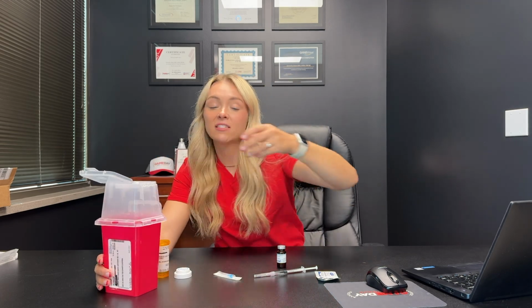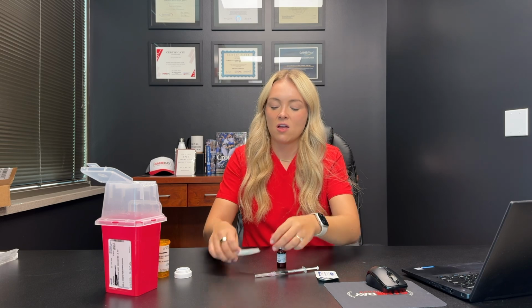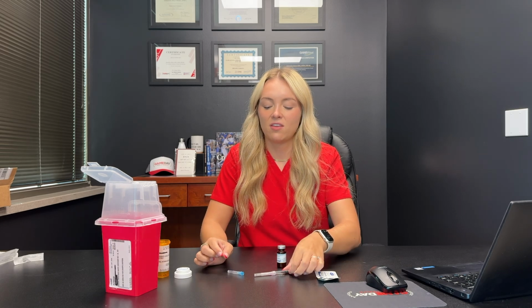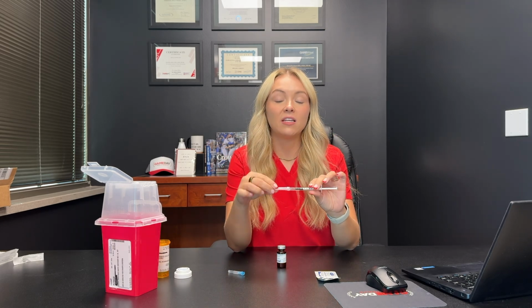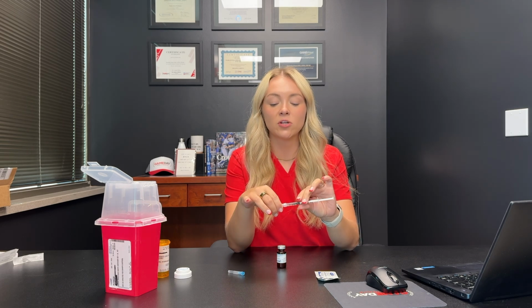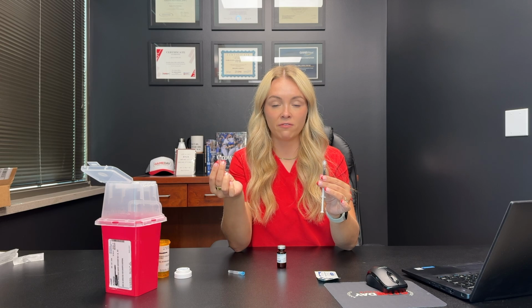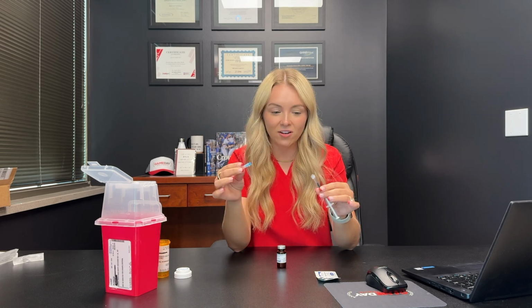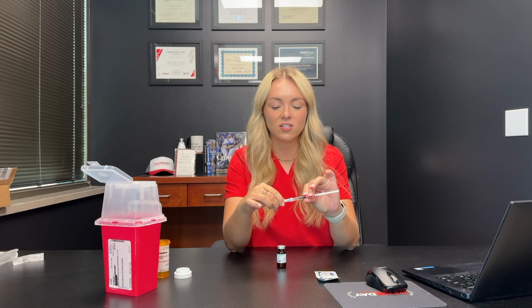Now again, this needle is pretty thick. If I were to inject myself with this needle, it would hurt and I would probably bleed. So I don't want that to happen, so I'm going to change out the needle. I'm going to make sure my sharps container is open. I'm going to open my blue 23 gauge needle to inject with. I'm going to firmly grasp the needle and the syringe, and this is a Luer lock, so I just need to twist for the needle to come off. I'm going to dispose of the needle into my sharps container, and then I'm going to take the blue needle, the skinnier needle, the nicer needle, and put it onto my syringe and twist it on.